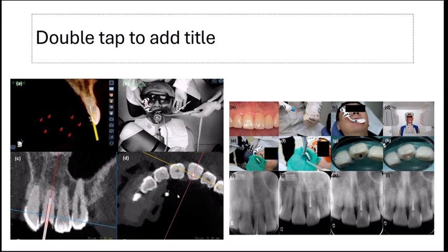The robotic arm was positioned and moved toward the maxillary central incisor under the operator's supervision, using carbide burrs operated at 30,000 RPM, and automated drilling stopped 3 mm short of the canal entrance. The operator continuously monitored and was ready to take control if needed, and canal patency after robotic execution was confirmed with an 8K file, confirming the canal orifice.